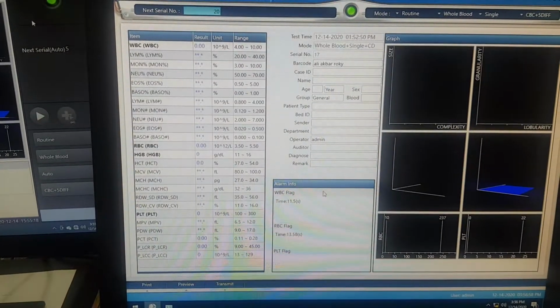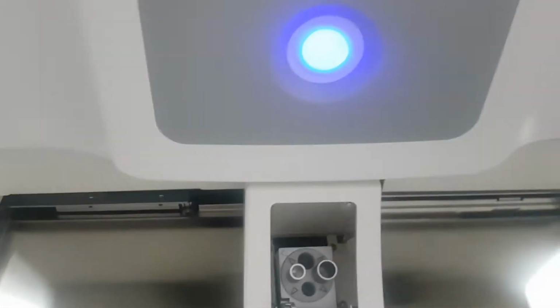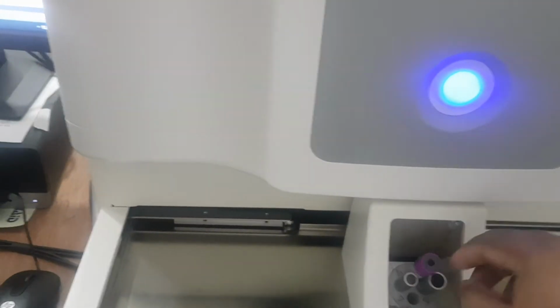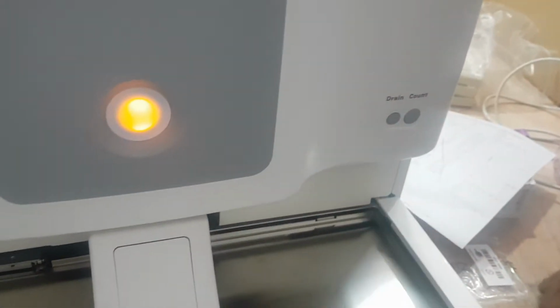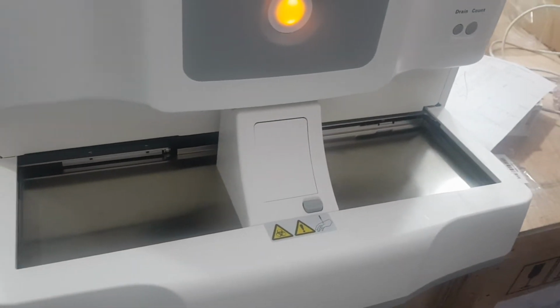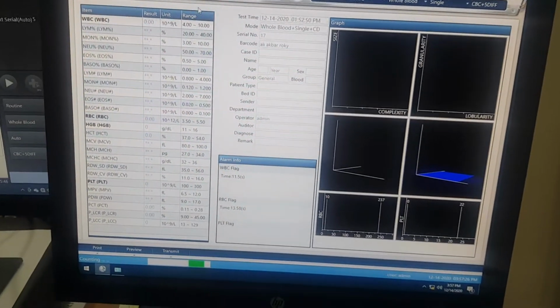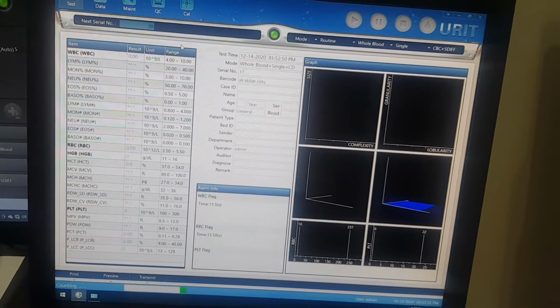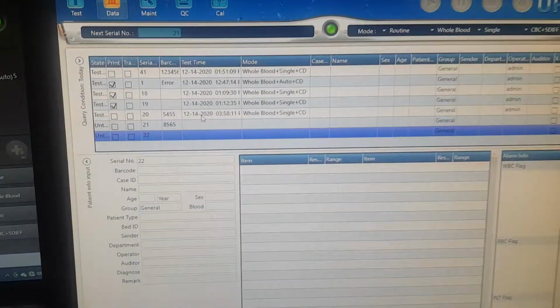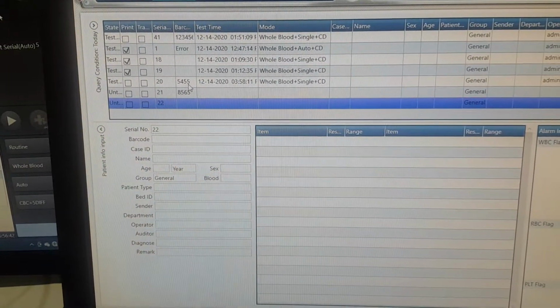Okay, now when we go for the test mode, if we run a manual sample, and we press count, let's see the serial number. We wait until the result comes. See, the result comes to number 20, and the barcode ID is 5455.